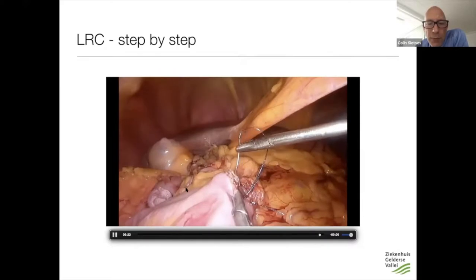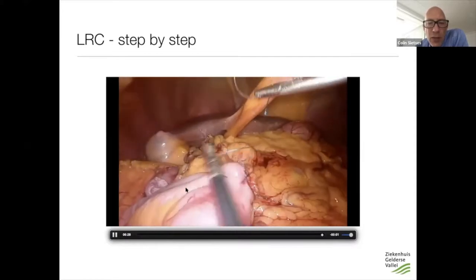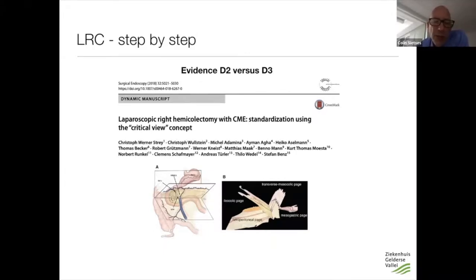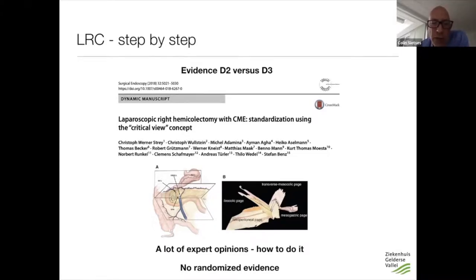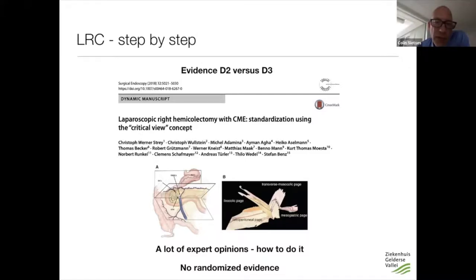So this is a slightly different procedure than Andreas performs, and we can also do it with a D3 dissection — but in the Netherlands we do a D2 dissection. What's the evidence for D2 versus D3? You should remember there is a lot of expert opinion with beautiful illustrations from very experienced surgeons showing how to do a D3 dissection, but there is no randomized data. A D3 dissection gives you more lymph nodes but also creates more risk, and the question is whether these risks outweigh the oncologic benefit.